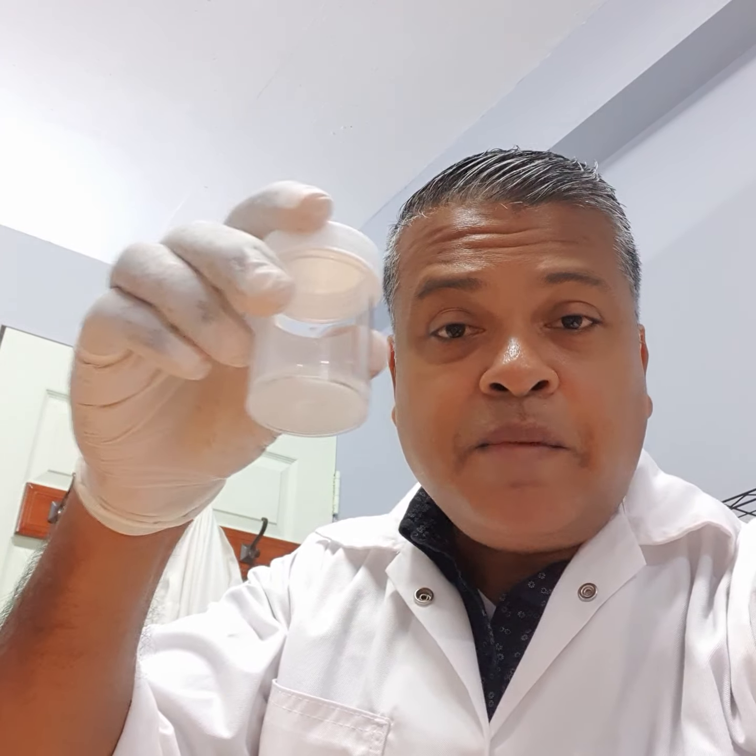sample from that patient, maybe the nose, maybe the throat, maybe a wound, vaginal tract, penile area, perianal area. Even if it's a UTI that they suspect, they're going to ask to get a sample that is reflective of that body site. So these specimens can be urines. Specimen can be semen, seminal samples. It can be swabs taken from different areas.